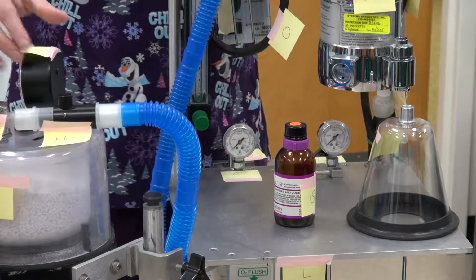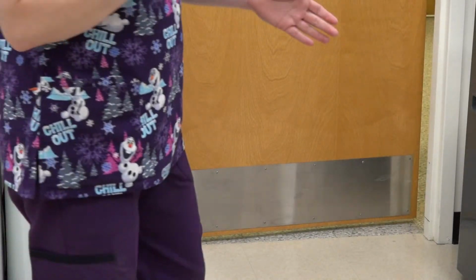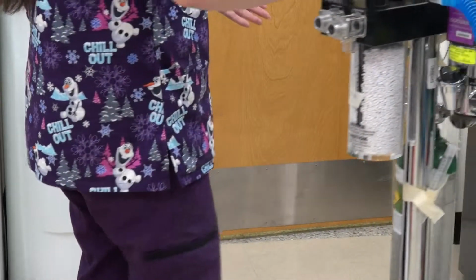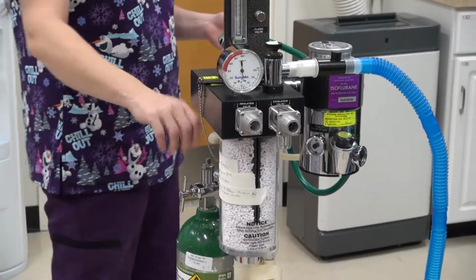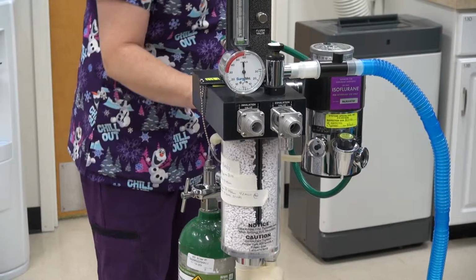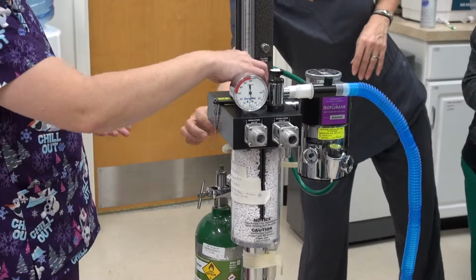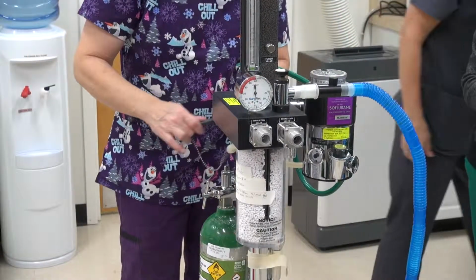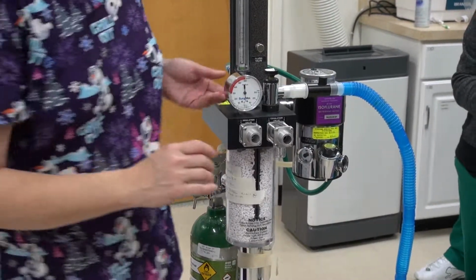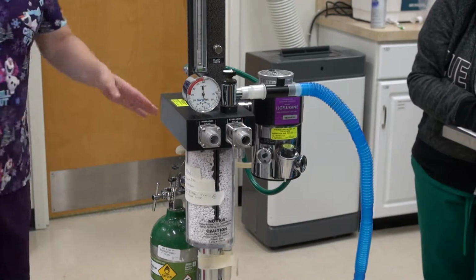Nelson, can you bring me over the other machine? Because I want to show you on that machine how to hold the pressure. Okay. This machine is working, so we're going to turn this one on. Stace, do you know where to turn the oxygen on this one? Oh, there it is. Thank you. Okay, so I'm just going to turn the oxygen on real quick, gang. Okay, my oxygen should be on. There we go.